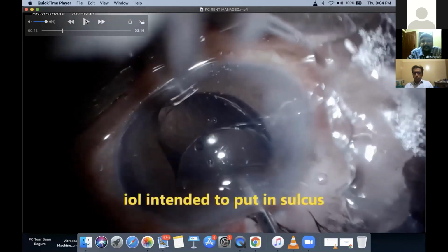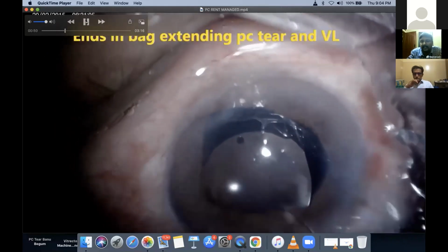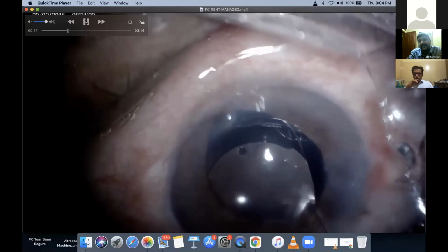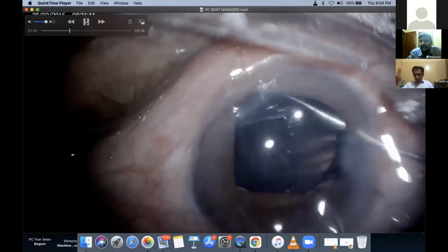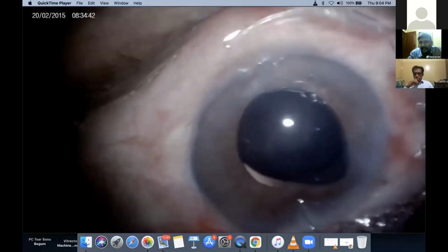And the lens was tried to be put into the sulcus. The main surgeon wanted to do it themselves, but unfortunately the IOL entered into the PC tear. So the IOL entered into the PC tear, and then we noticed a vitreous loss there.